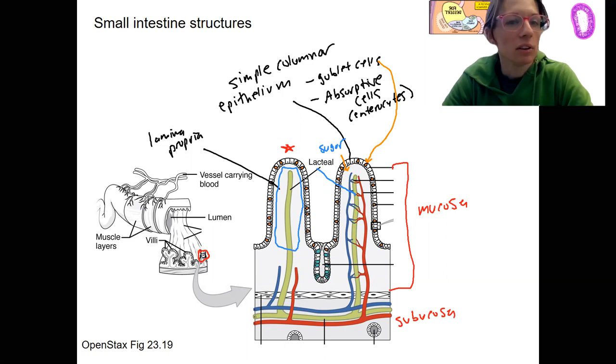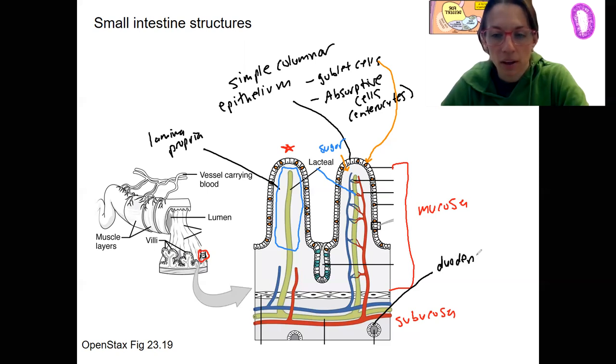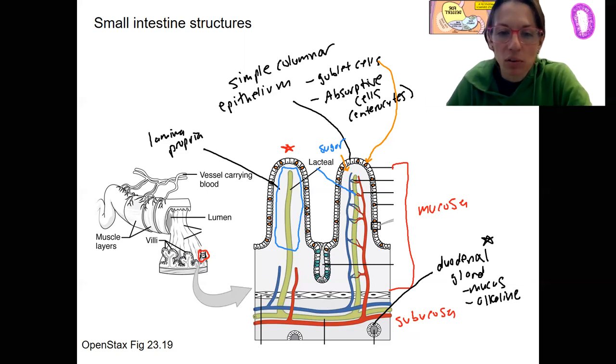Okay. Two more things, I believe, on this picture. One is, both are types of glands. One is our duodenal gland, duodenum, duodenal. That's specific to the duodenum. Duodenal gland. These are mucus producing. They're going to produce an alkaline substance that helps to neutralize the stomach acid coming in. So these are only in the duodenum. They're in the submucosa, right? You can see that.